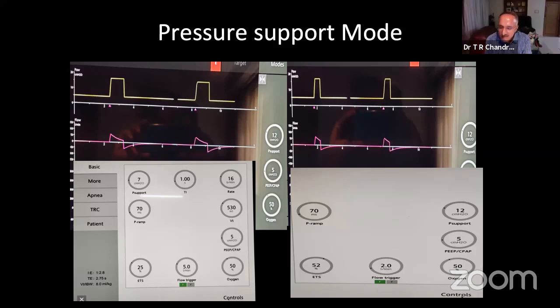You are always looking at airways and alveoli on those lines. That is the take-home message. You are not just looking at lines. You are seeing what pressure the volume is generating in the alveoli. You are looking at what pressure each tidal volume is getting by looking at the driving pressure. By looking at the difference between peak airway pressure and plateau pressure, you know how much pressure is required to push the volume through the airways. So much information is available. You don't need to do anything other than learning this science and ventilating patients more scientifically.